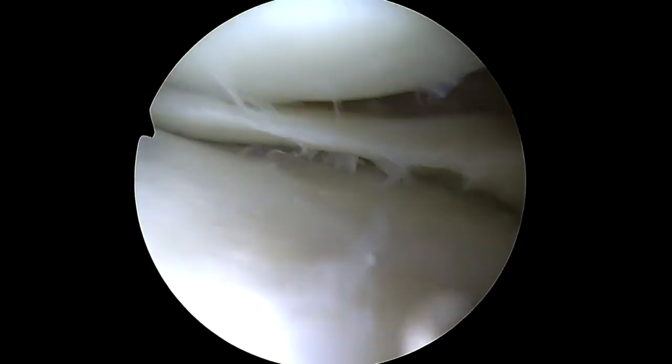This double-sided repair provides a global compression upon the lesion's entire surface.